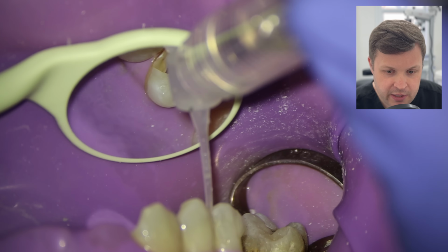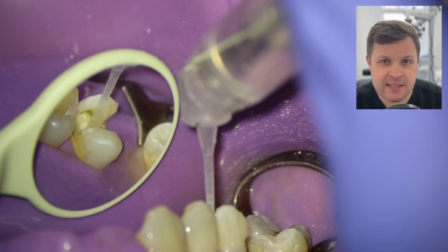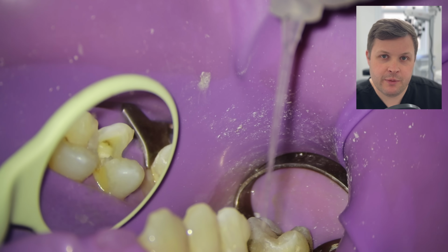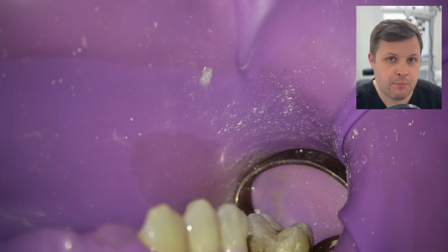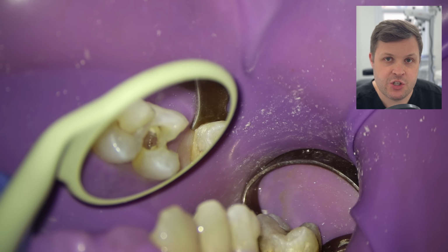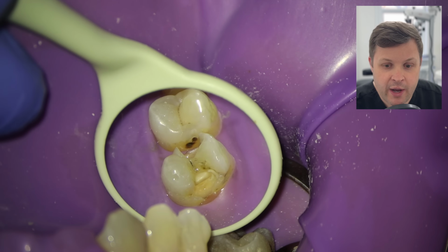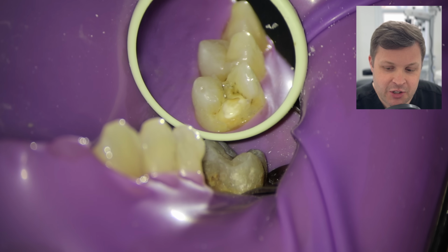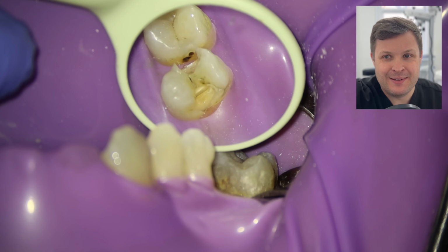And then as we irrigate this tooth, we can visualize this dentine bridge a little bit better now. And I suppose in a way I am thinking to myself, is this all worth it? Is the pain and the bother here? But I think, as we mentioned before, the premolar is quite a weak tooth. It's kind of the size of an incisor, but takes the brunt of a molar. So I think any conservative actions we can do on this tooth, any chances we can take to conserve tooth tissue, and also to try and stop or minimize any wedging force on this tooth, I suppose in a way this is going to make the tooth last a little bit longer. So that's my justification for leaving this dentine bridge in place.